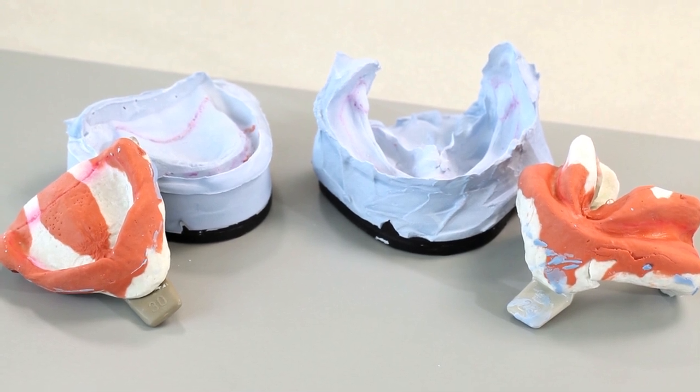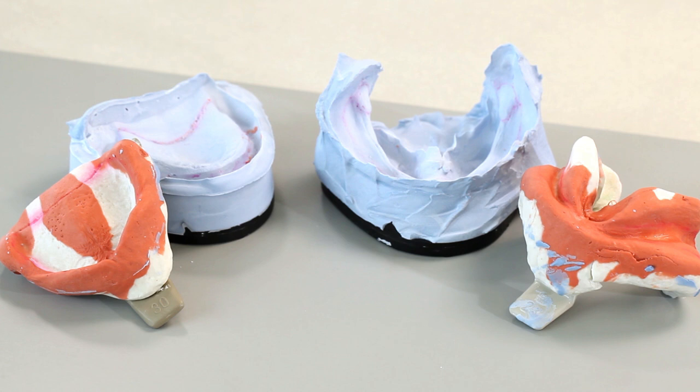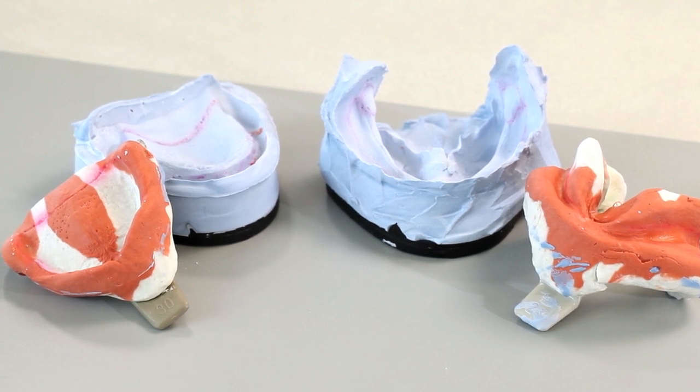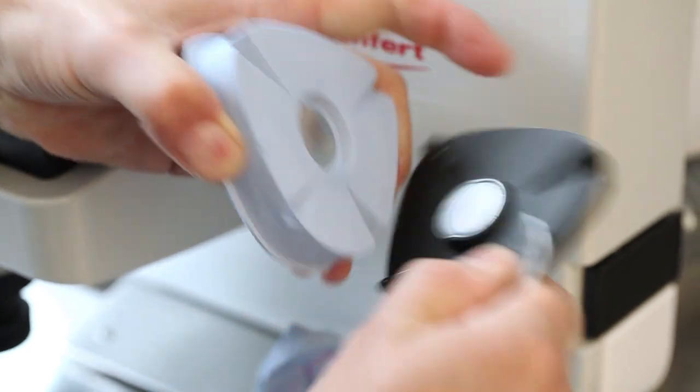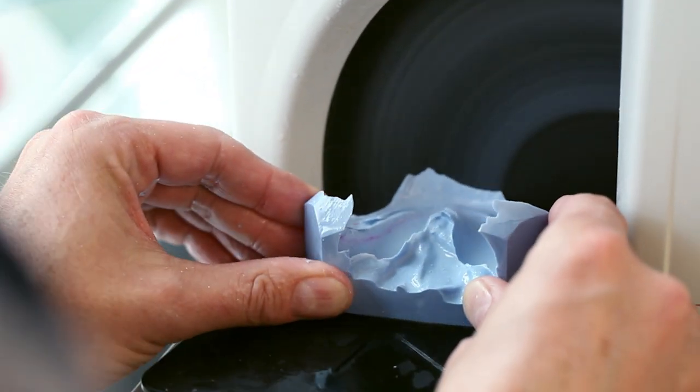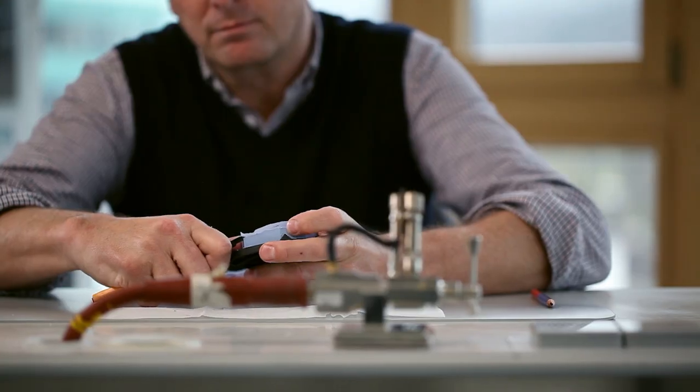Remove any flaws from the impression, such as air bubbles, pressure spots, extraction wounds, flabby ridges, etc., already at this stage. Use a split cast plate. Detach it now. Trim the models and smoothen the sharp edges.